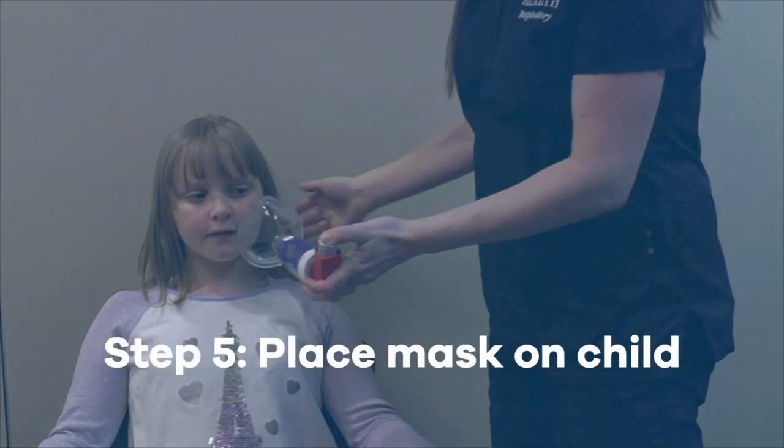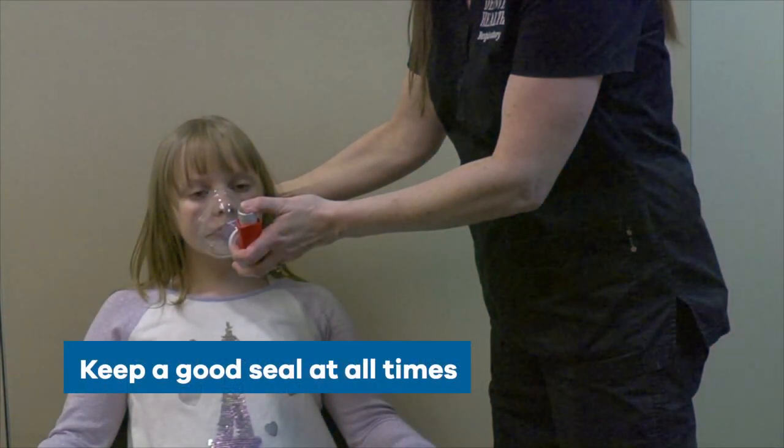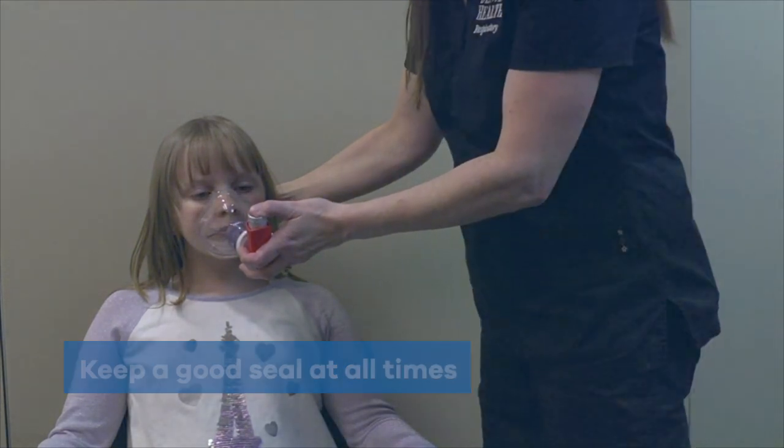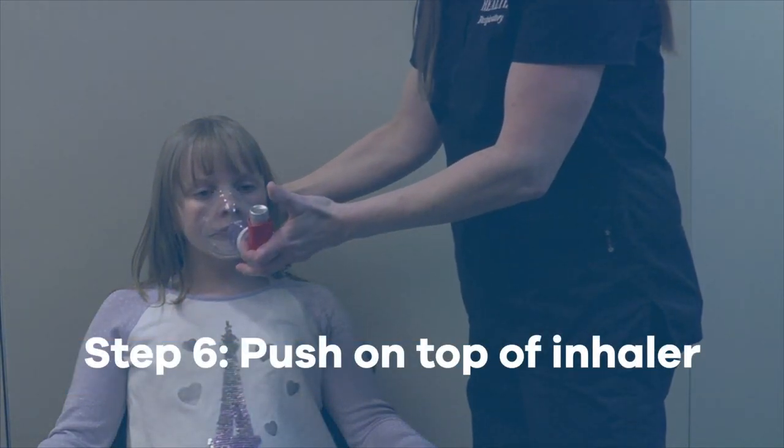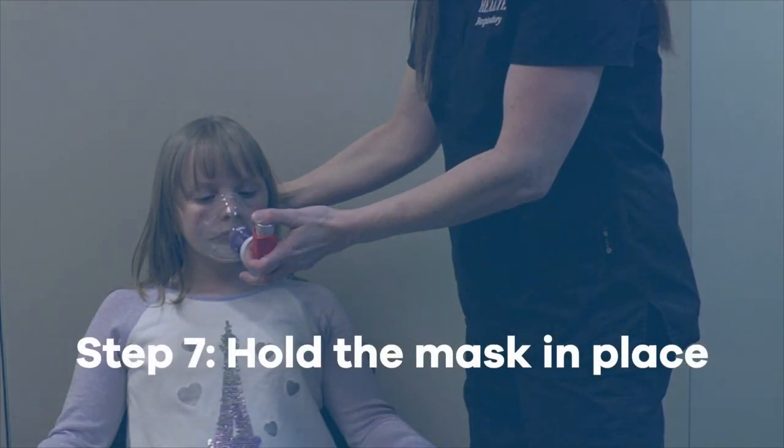Step 5: Place the mask firmly against your child's face — make sure to keep a good seal at all times. Step 6: Push on the top of the inhaler to make it spray medicine.